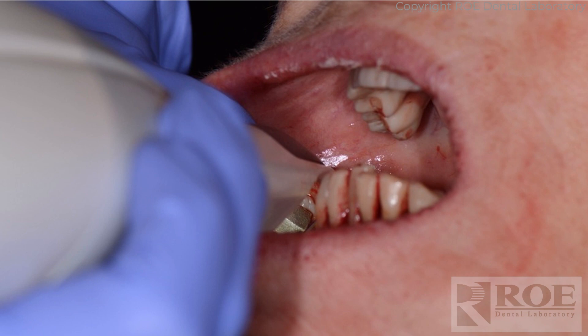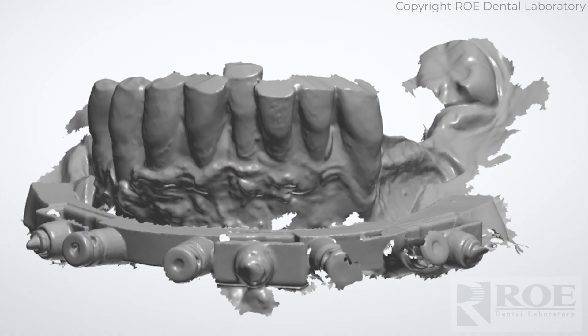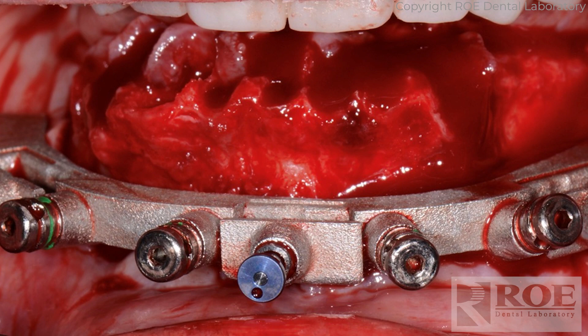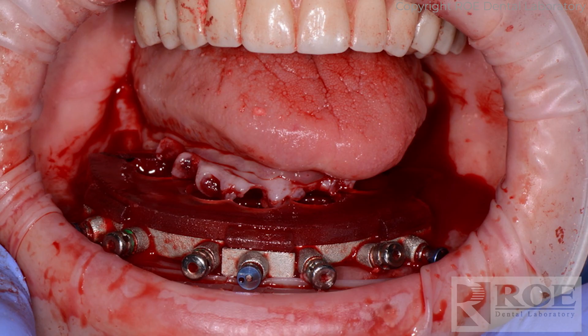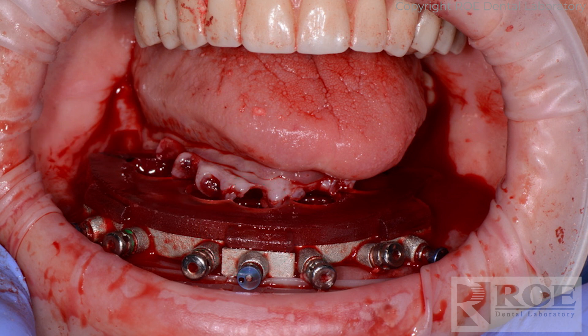Surgery proceeds: teeth come out, bone is leveled down to the fixation base. This is the bone leveling surface — from here back, palatally, giving a smooth transition from metal to bone for nice guidance during bone reduction. Double-check bone reduction with the carrier guide, which must seat passively with no rocking at all. If it rocks, go back and adjust the bone or reflect more tissue as needed. Next, drill the sites using the metal osteotomy guide — very rigid, with little nubs for rotation to ensure perfect indexing when placing the implants.